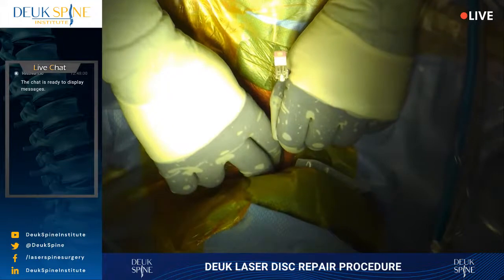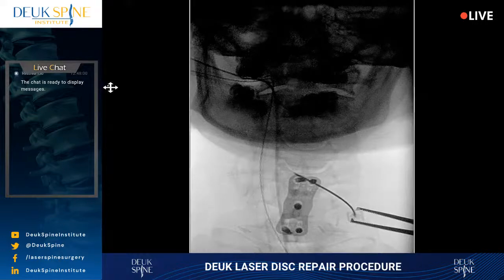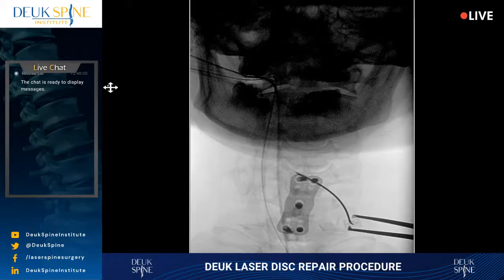All right, so we're starting to get in there. Let's get an AP again just to make sure we're in the middle. You okay up there? I need you to give me a little inline traction, which is extension and pulling. So kind of rocking her head back. There you go. All right. Again, AP. A little bit off to the other side.